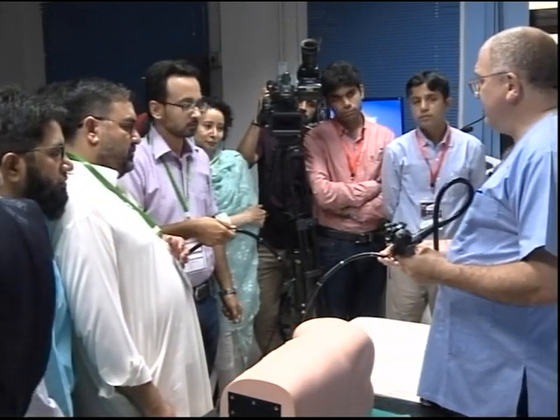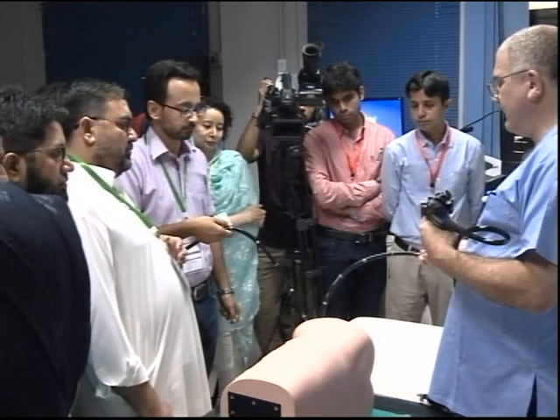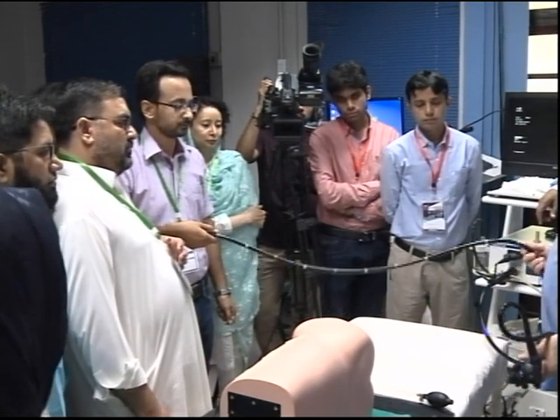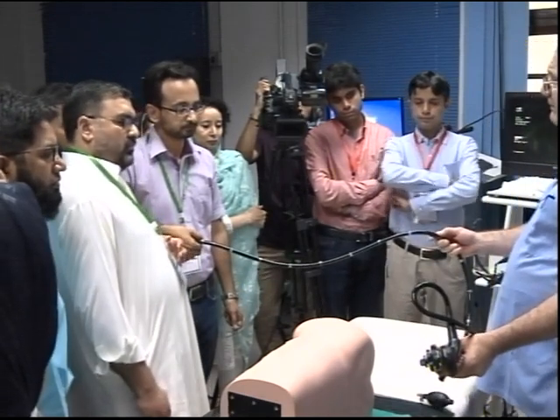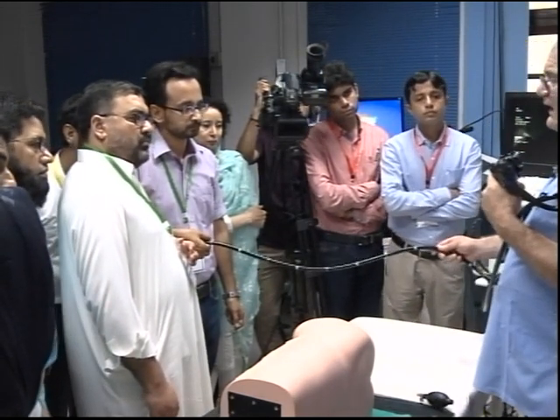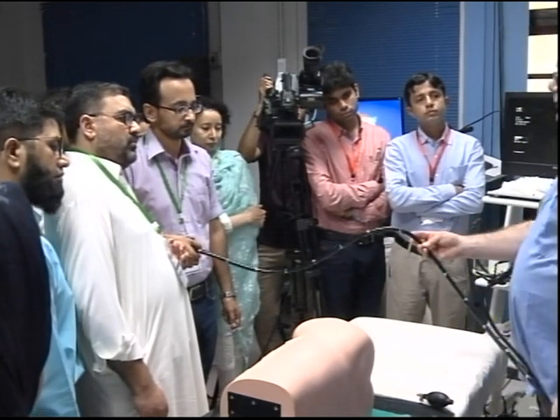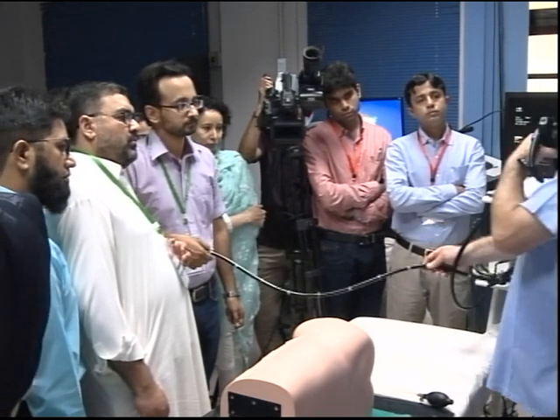Now see how much space that takes up, right? As I draw back, I take up less space. I increase and I take up less space. Yeah? I then bring back, keep the torque, see this scope here? Now if I actually allowed that, it would then reform. If I keep my hand down here, it won't reform. The scope will stay stiff. And that's why I hold this in that format.